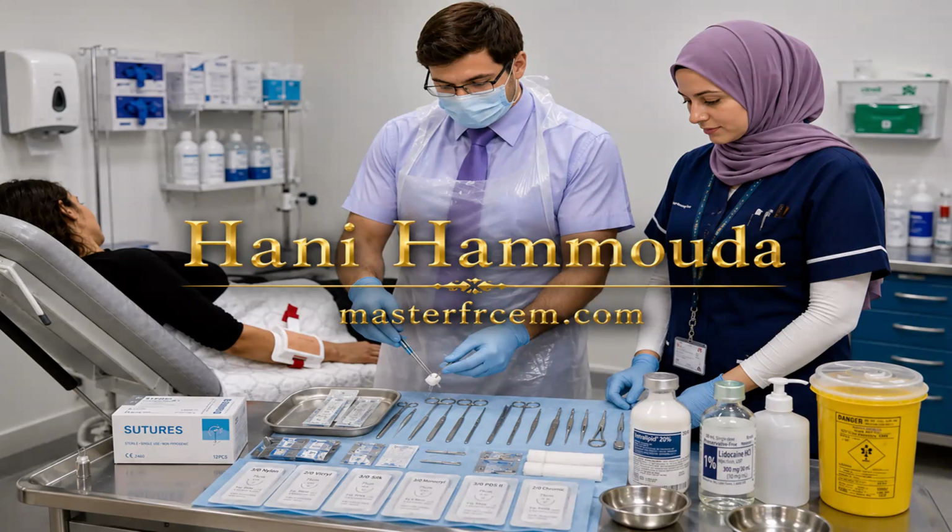I believe you have one patient for suture, sir. Please prepare equipment and mention the equipment: needle, thread, needle holder, forceps, and scissor. Also normal saline, iodine, and intralipid. Clear? Yes, sir. Okay. Then go to the patient.